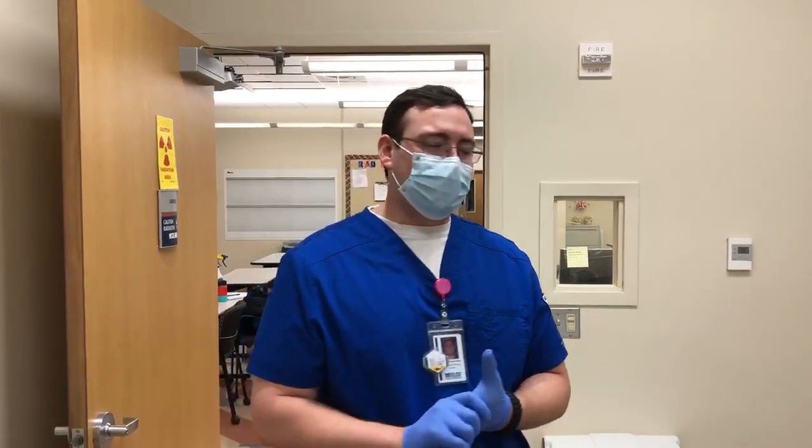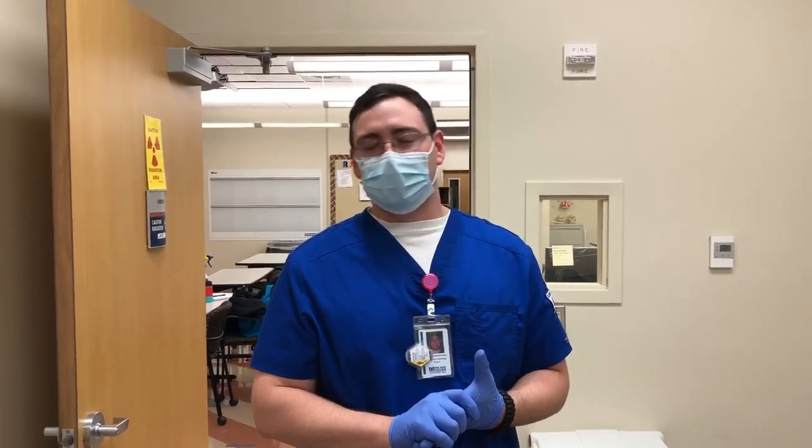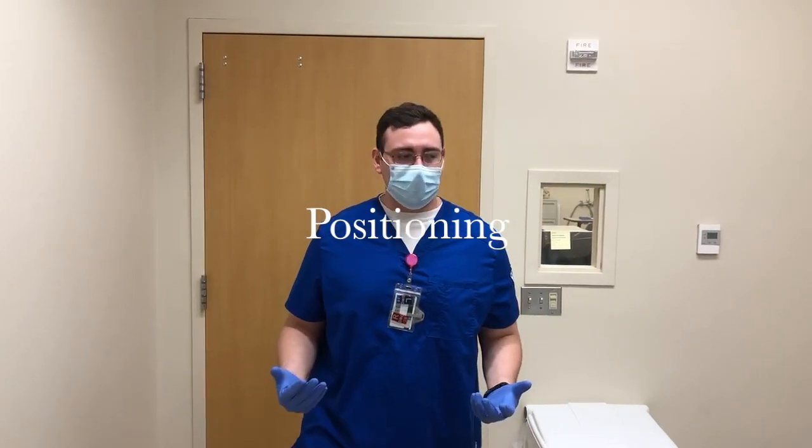Today we're going to show you the projections for the thoracic spine. Pathology is going to be kyphosis, subluxation, fractures, and zygapophyseal joints with the oblique positions. Let's get it. So I'm going to be demonstrating the AP T-spine.